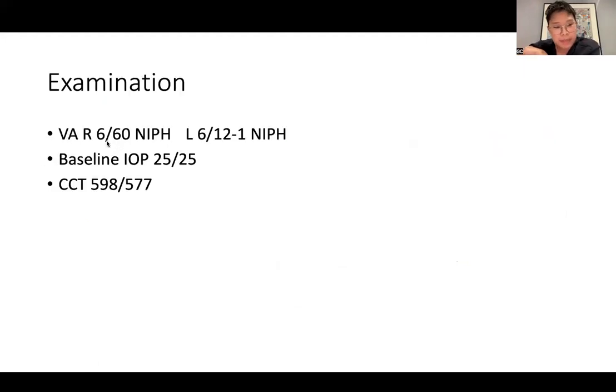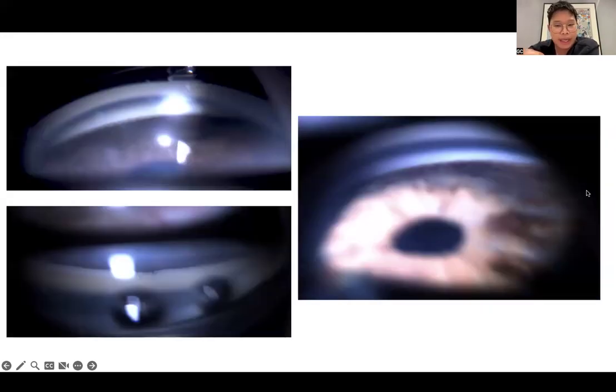So here the patient actually presented, remember his right eye is the amblyopic eye, with a vision of 6/60, his left eye was 6/12, pressures of 25 in a highly myopic eye. And so really a diagnosis of secondary glaucoma was made. Gonioscopy showed that there was a significant Fuji sign, and here you can see a volcano iris configuration. And this patient had essentially closed angles with a lot of pigment within the angles on gonioscopy. You can see that superior angles are closed there with, once again, pigment blotching. And so really there's a secondary pigment dispersion as well as a secondary angle closure that's happened here.